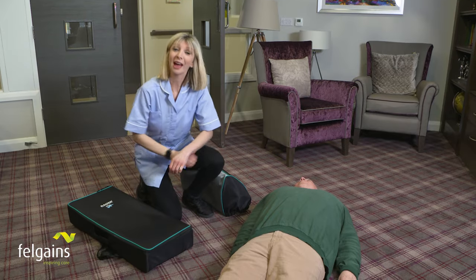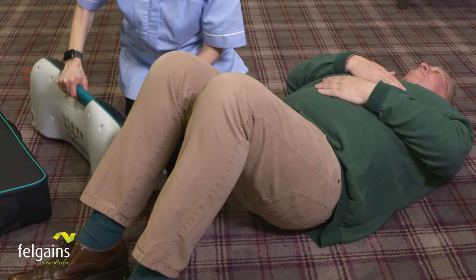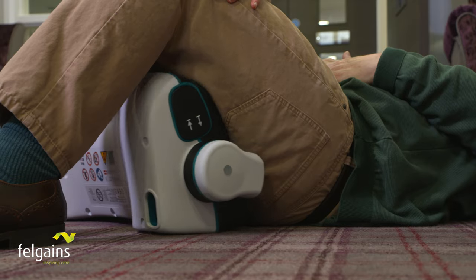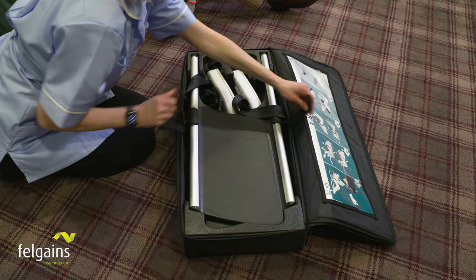It's easy to carry and quick to assemble. Razer 2 builds on everything that's best about the original Razer 1 in an improved package with added features and benefits for even easier use.